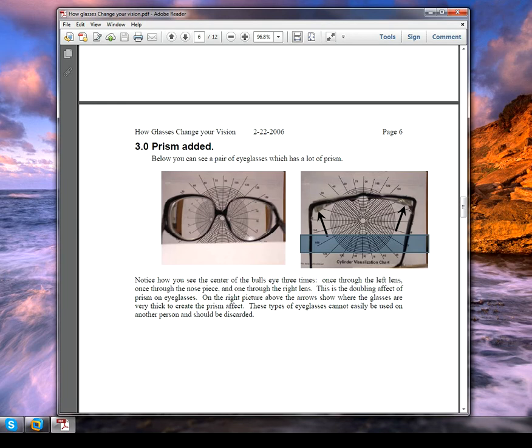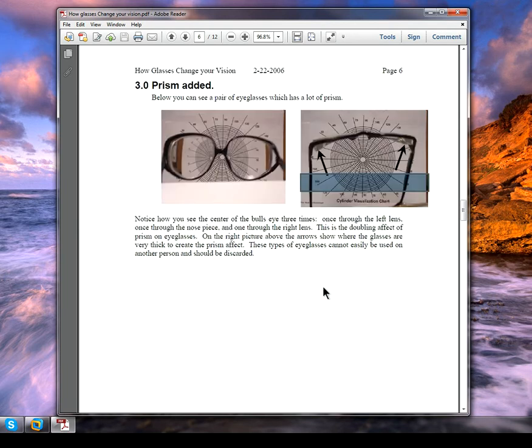Essentially, the prism basically refocuses the light so it goes straight into the eye, regardless of whether the eye is turned in or out, up or down. If it goes straight into the eye, then they don't see double, like they would see if it weren't for the prism glasses. We don't circulate glasses that have prism, as the number of combinations are virtually endless and really can't correct it. But sometimes when you have a turned eye, if you put a pair of glasses in front of the eye that matches the prescription, that eye will straighten right up. Happens frequently with children.